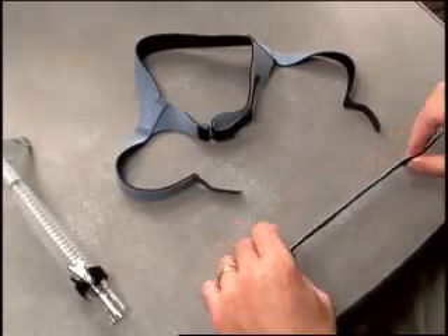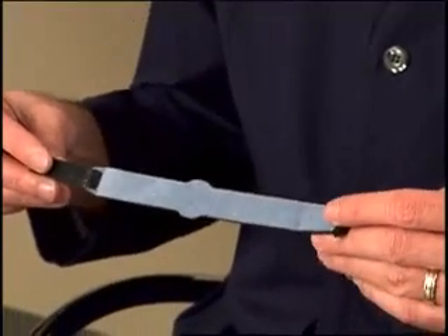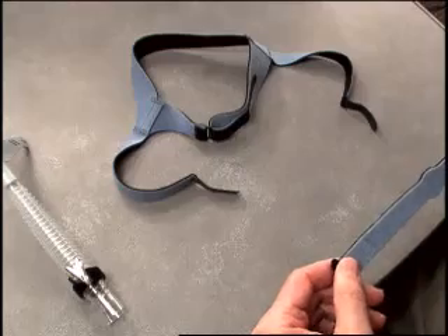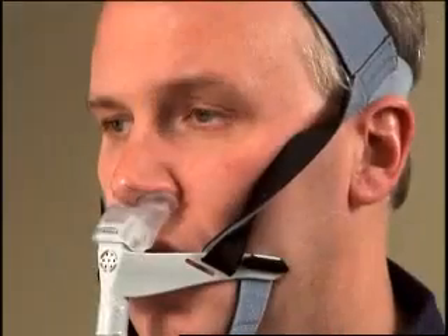The outsides of both the chin support band and headgear are blue, and the sides that go against the head and face are black. Remembering the proper orientation of these colors on the headgear and chin support band will help you determine if your headgear is twisted or reversed.